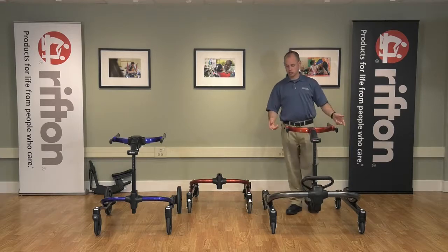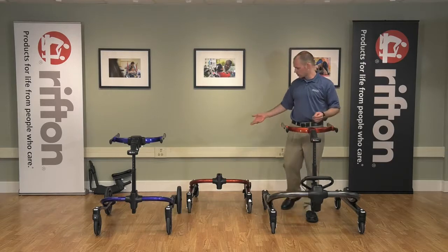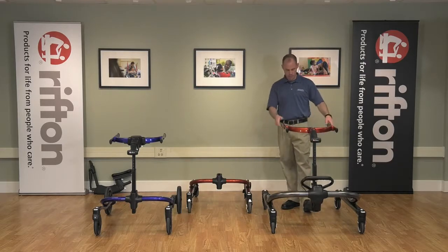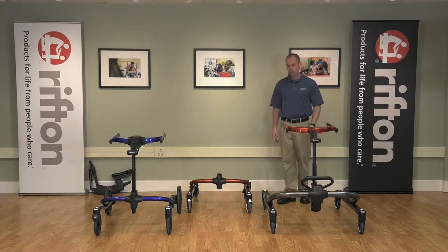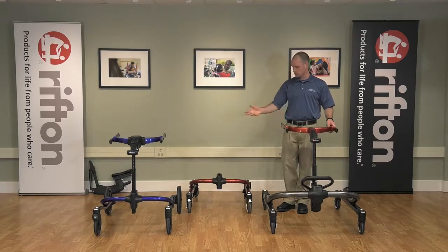The casters on the treadmill frame, again, you have your odometer caster, and then you have all the same features of your standard base on the treadmill base casters. So that covers our three bases. At this point, does anyone have a question on any of the bases or any other question on the material I've covered so far?